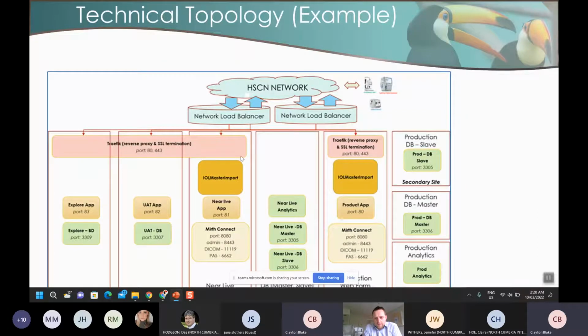Now, in addition to the base environment that you have, if we look at the production system, you'll have your application server and your database server, and for the technical people, that's using a LAMP stack. Occasionally you might have a reporting server, which you can use to offload reporting, or you can access it directly from your data warehouse. So it's a SQL database, so it's quite easy to pull all the reports and everything off.